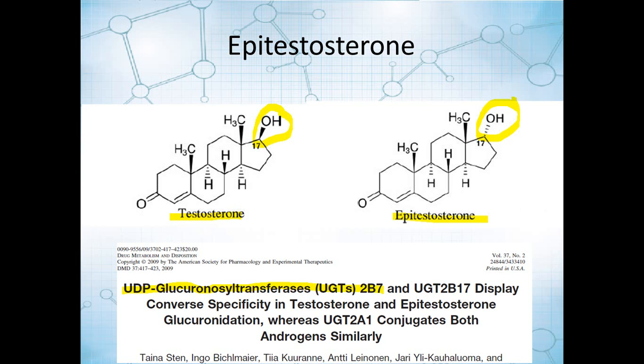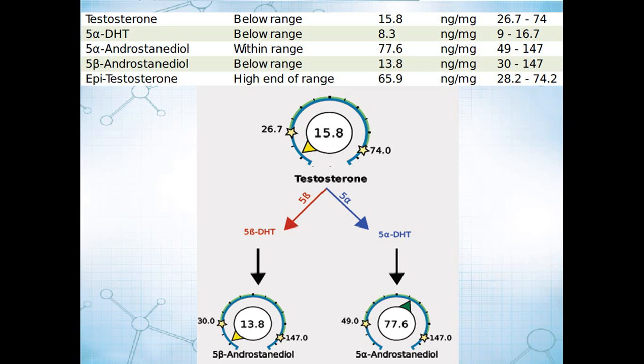That's what that is there for, to make sure that we can have confidence in those results, because urine testing always assumes proper phase 2 metabolism, and when that doesn't happen because of a genetic defect, which is, again, pretty rare, there aren't a lot of known cases of that. But this is one instance, and that's why we've added all these other metabolites so that we can pick up this pattern when it happens.